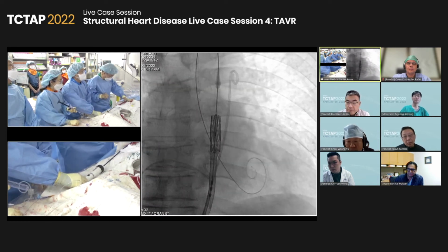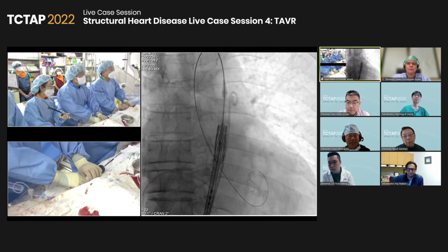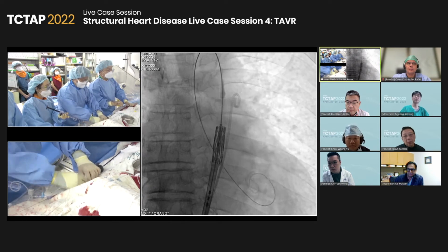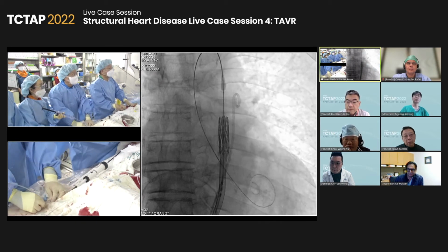And again fine tuning, exactly the same place. Just a moment. It's okay. Great.